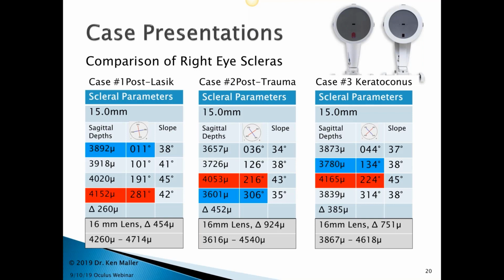Here's 3 random eyes, and they're ranging from 300 to 400 microns of toricity, and it's not necessarily even regular toricity. And so if you can address that in your design, I guarantee you will end up with a more successful case. So if you have a spherical design, maybe you've been successful, but if you design and deal with this asymmetry, you will absolutely positively be more successful.